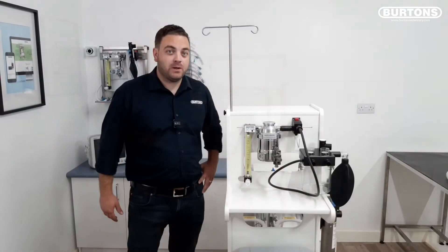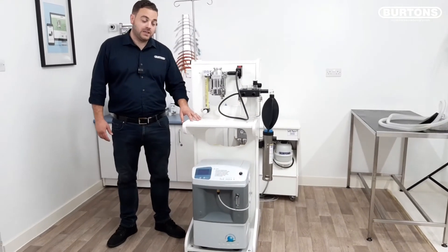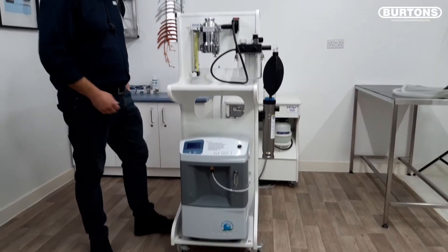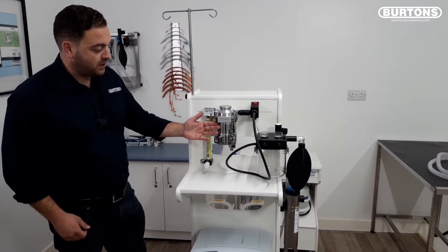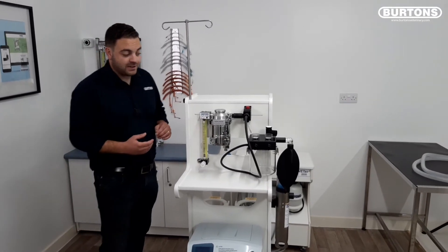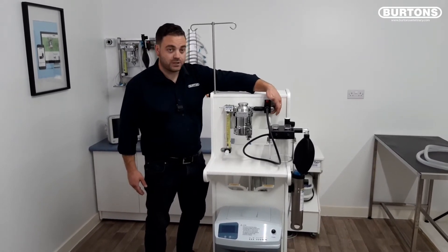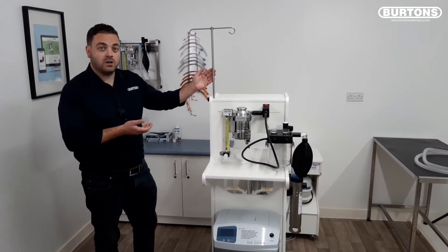Here we have the Burtons Adaptable 2 machine. This is our first machine to be constructed out of a sealed wipe-clean antimicrobial material. This machine has been specified with the optional oxygen concentrator and cycloflow circle, and also with the optional isoflurane vaporizer in key fill variety. The machine as standard comes with the high accuracy rotameter and corner unit with flush button and pressure release valve. This particular machine has also been specified with the optional IV pole.